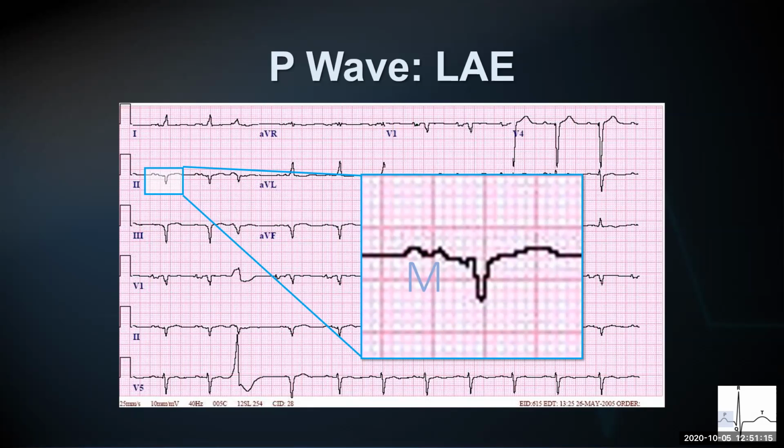If the second part of the biphasic wave is bigger, you mean it's left atrial enlargement? Yes. So that second region in this area that I didn't zoom in on in V1 would be suggestive that this could be left atrial enlargement. But the M appearance, the P mitrale, can also be suggestive of a left atrium. So if you see just the sinusoidal biphasic appearance in V1, and you don't see anything in lead 1 or 2, I probably wouldn't automatically call it left atrial enlargement. You should see it in both.